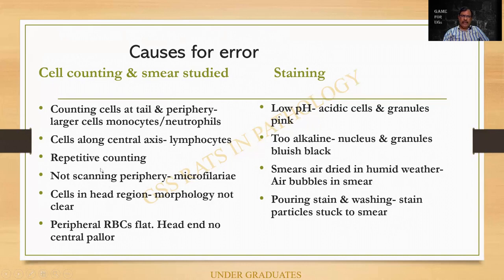Not scanning the periphery. In fact, I am supposed to scan the slide under the low power or even the high power to rule out parasites such as microfilaria. Microfilaria is an exam slide that will be kept under the high power, not under oil immersion.